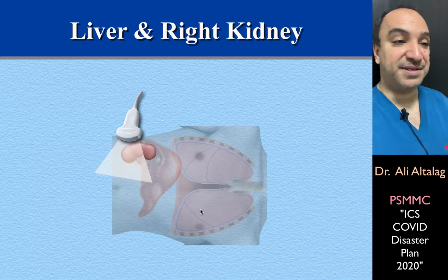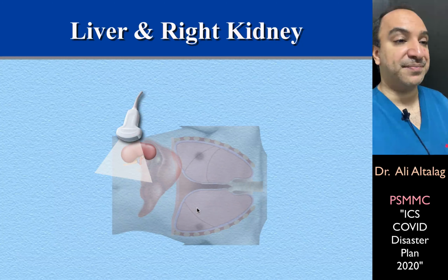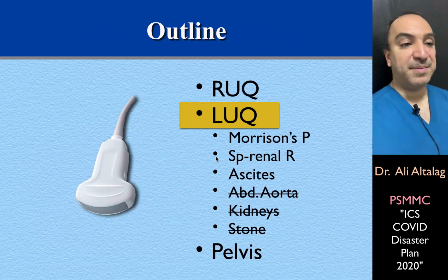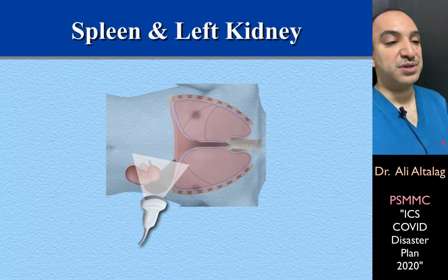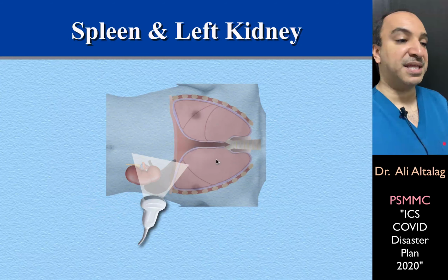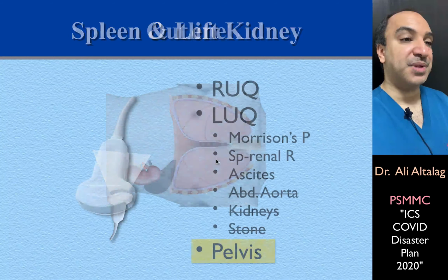and also in the pelvis. That's why we examine these particular locations mainly. Left upper quadrant, we do exactly the same. We put the transducer trying to view the diaphragm, spleen, and kidney, and then we move the transducer downwards.